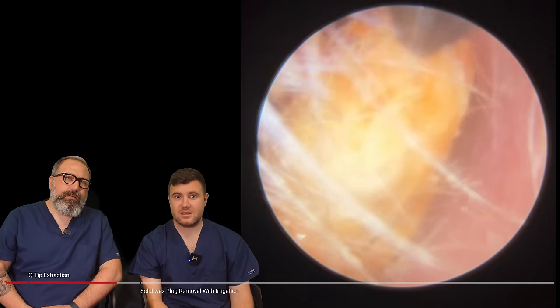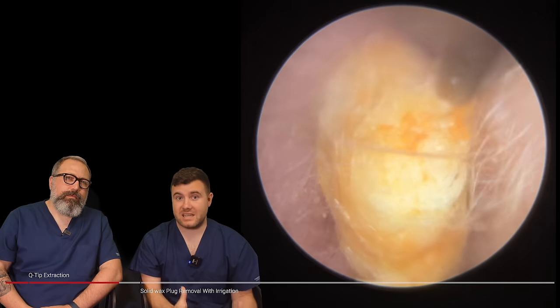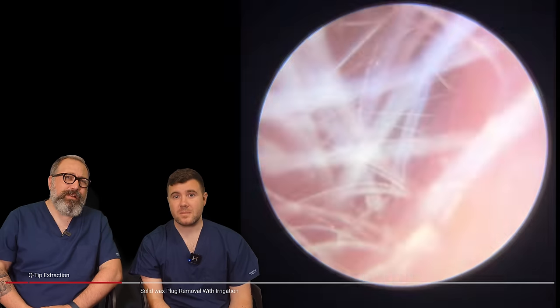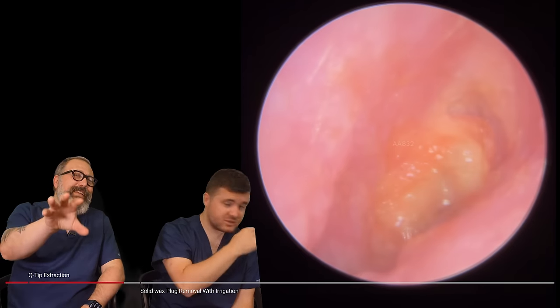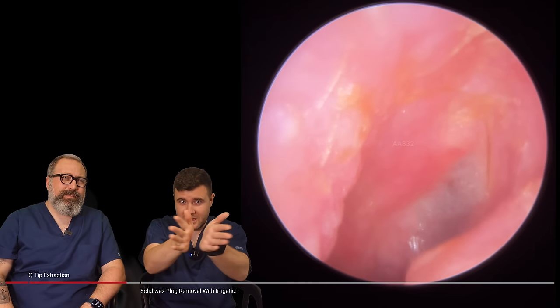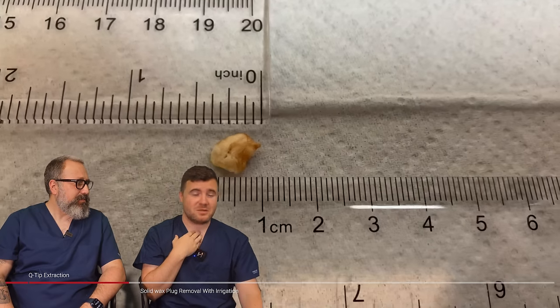Look at the size on it — cotton buds are only one particular size anyway, but look at that. That's the entire end of a cotton bud, that is. You can see where the bottom there was — look how irritated that is down there, just sitting there. And you can see the ear canal kind of... yeah, there's some deep recesses there as well.